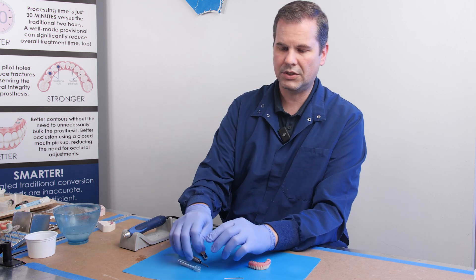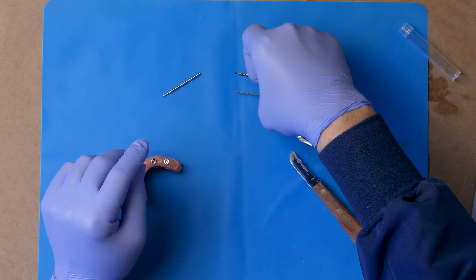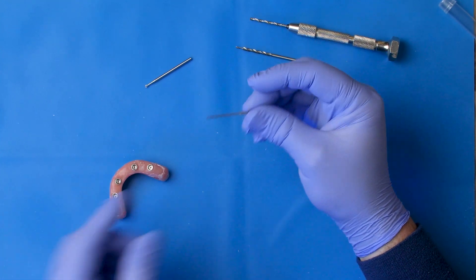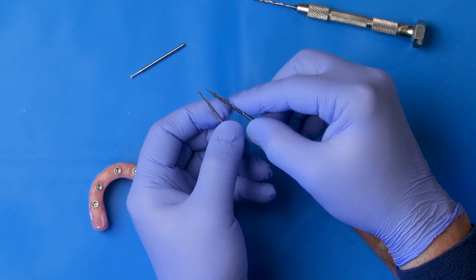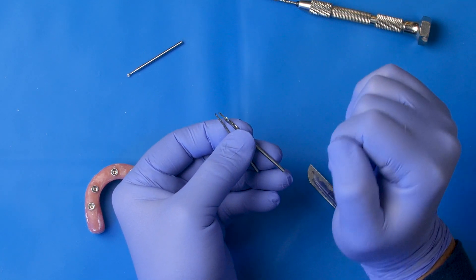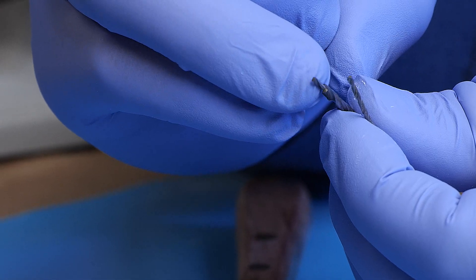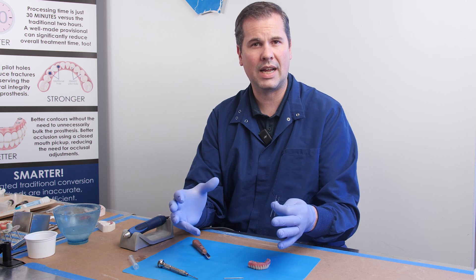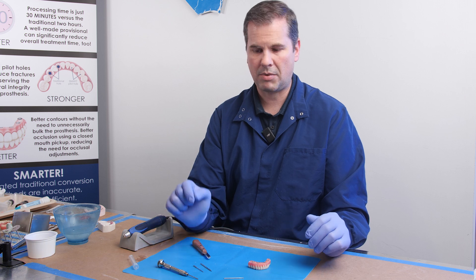Now I'm going to use the first drill in a series of three drills. It's going to go pilot drill, then access drill. If you look at this drill, it's got the same tip diameter as the pilot drill, and then there's a wider portion of the drill about six millimeters down from the tip. That wider portion is going to enlarge the diameter of the screw channel to the final diameter after we've done the pilot drill.